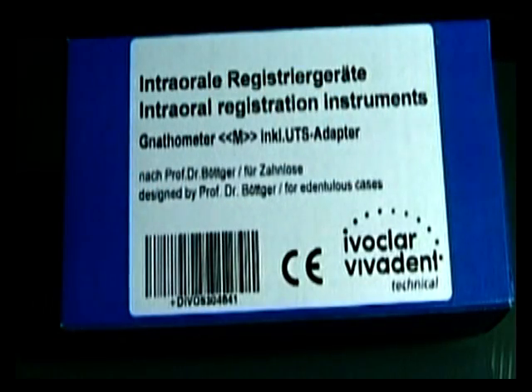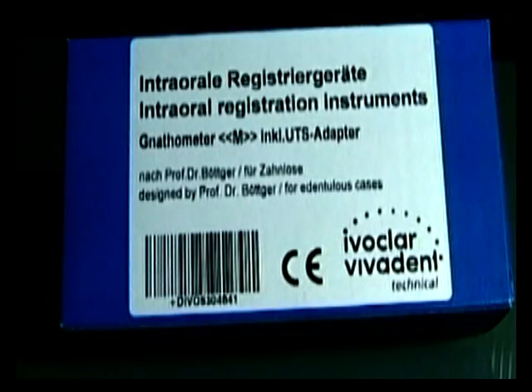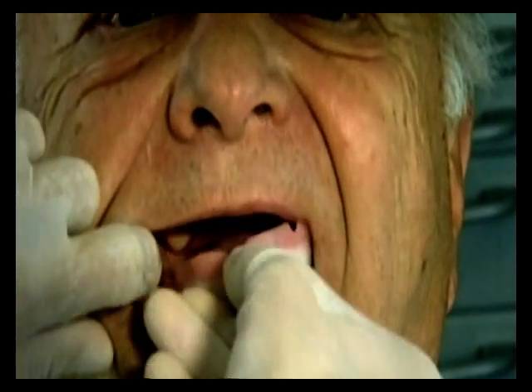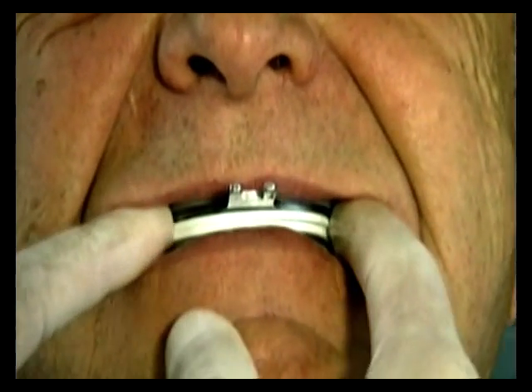The gnathometer M with the UTS adapter, the intraoral registration of the Gothic arch, is an efficient way of determining the maxomandibular relationships in edentulous patients. Check the individual trays with the bite rims in the oral cavity. The bite rims should close completely with the load being evenly distributed.